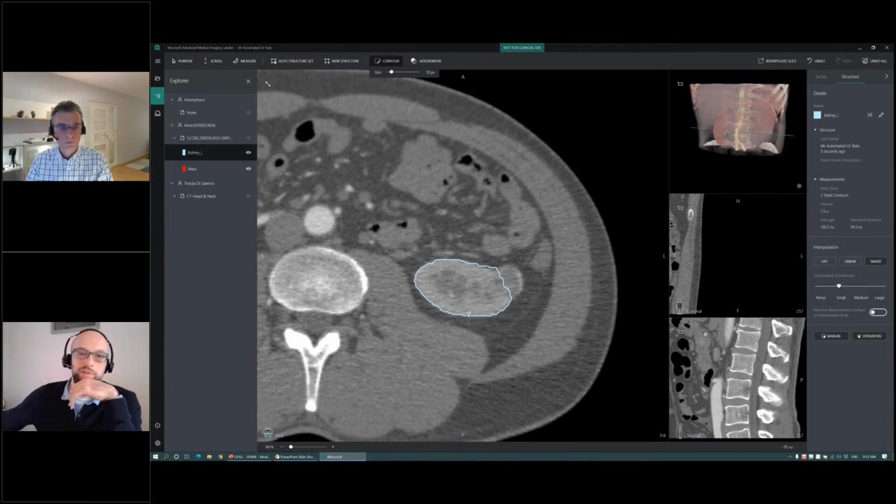is develop methods for speeding this up. One way to do that is building machine learning models that can automatically segment organs, and that's a machine learning problem. There's a lot of fantastic work on segmentation right now. We have built an automatic segmentation framework, which, by the way, has since been open sourced and is available on GitHub. But we also built this tool, which we used a lot internally to segment our own data sets. And we've thought about how to improve this process of clicking, and how we can deal with segmenting without having to label every single slice.